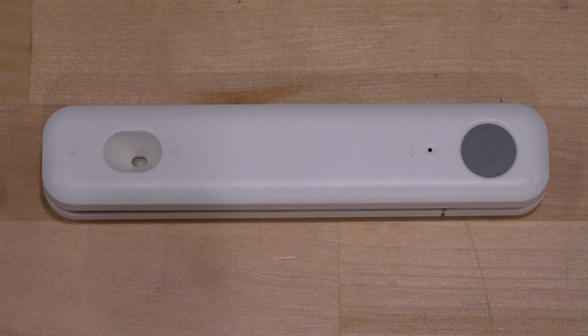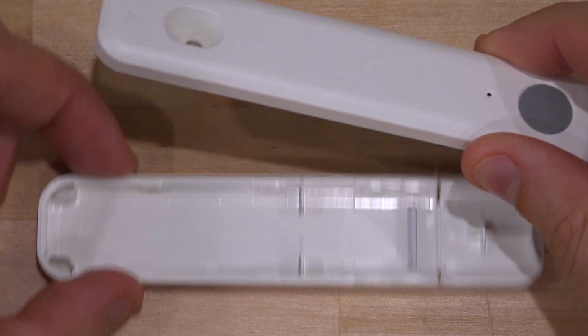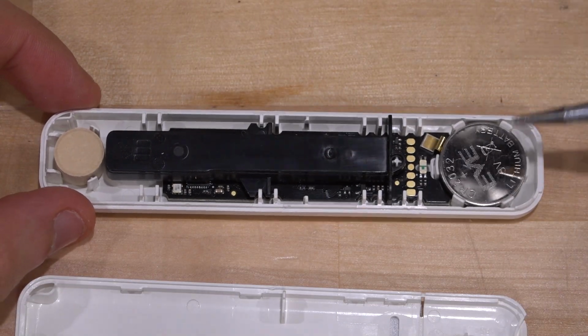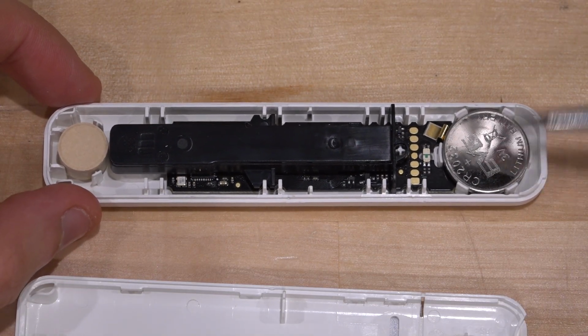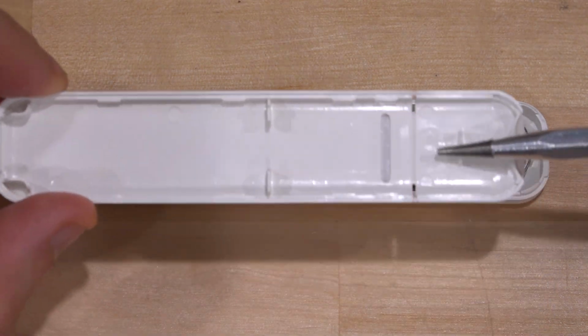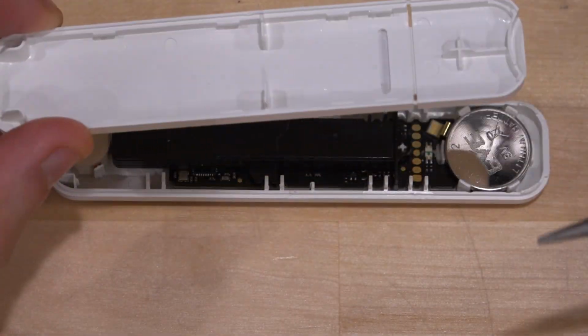So let's see what we have here. It was actually quite easy to open, just plastic tabs holding it together. Let's remove it. Okay, there's the bottom. And there it is. Look at that, it looks nice. So we do have a coin cell battery in there, which kind of makes sense. It's probably the cheapest and fastest way to get a hold of a large number of them. There is an interesting little cutout at the bottom, perhaps in order to make sure that it stays dry inside.